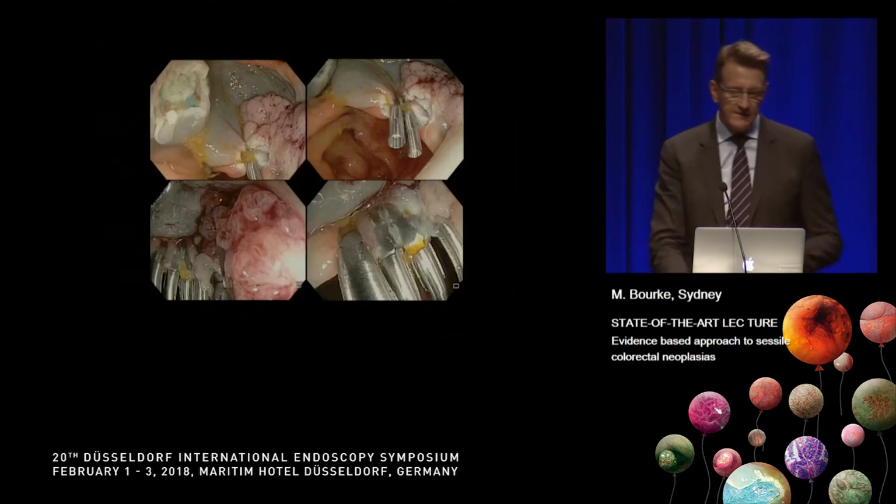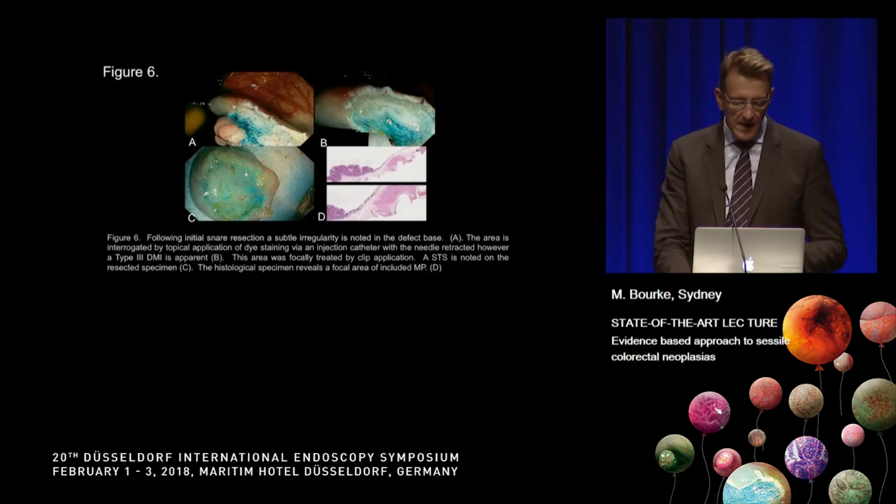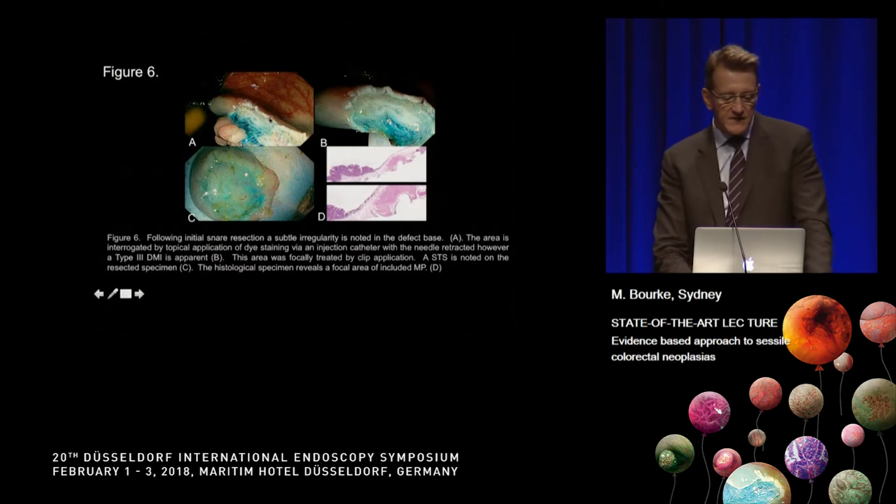But this can be dealt with easily now. I think everyone is now very comfortable with clip closure, and it's very safe in the colon. We need to recognise that these manifestations can be quite subtle.